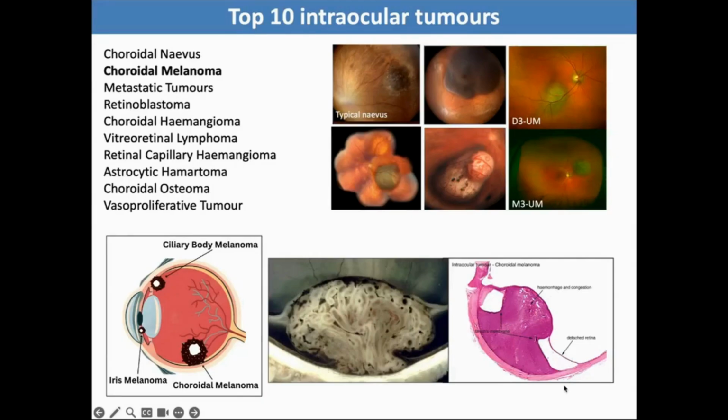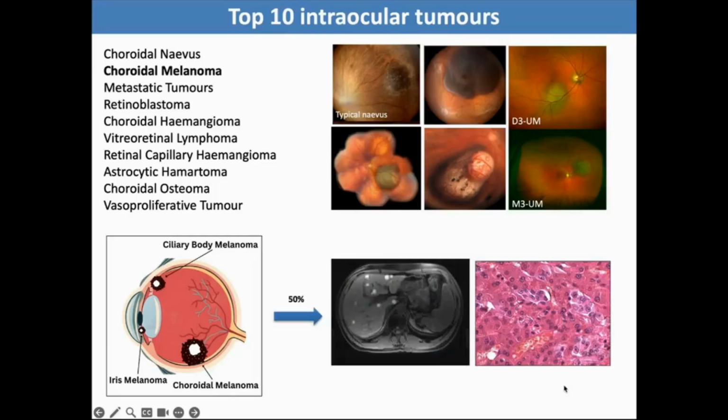This is the corresponding histology image. 50% of the patients, despite excellent treatment using either surgical or radiotherapy means, unfortunately develop metastases to the liver.